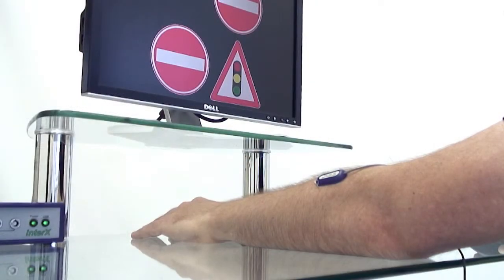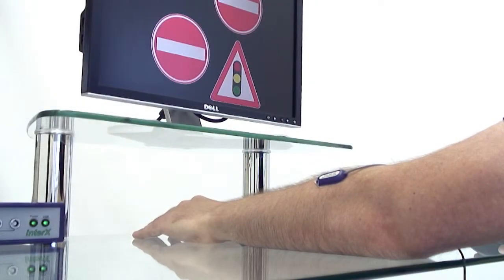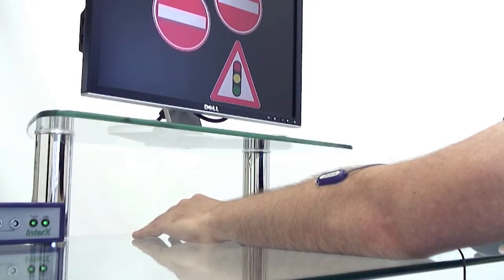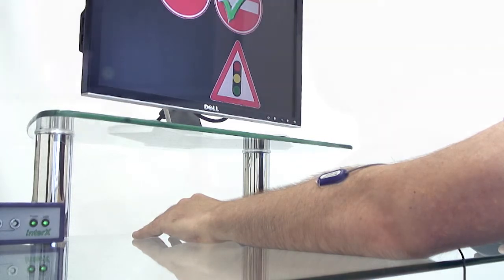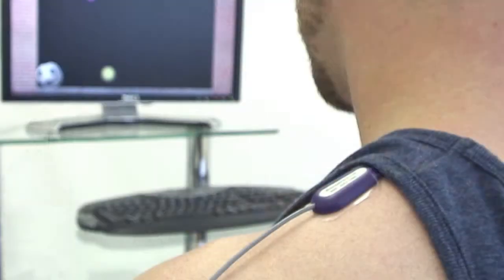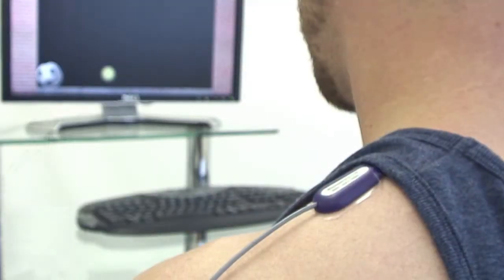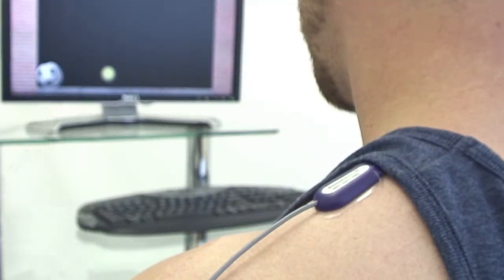The greatest benefit of MyoX is that it can be used in early rehabilitation as soon as there is the smallest flicker of voluntary muscle control.